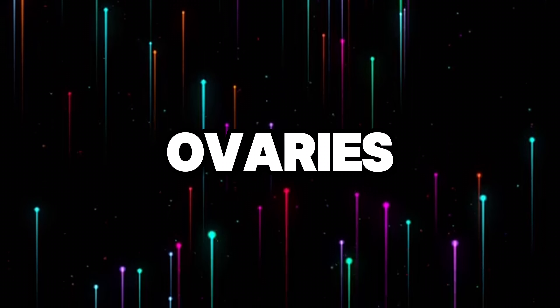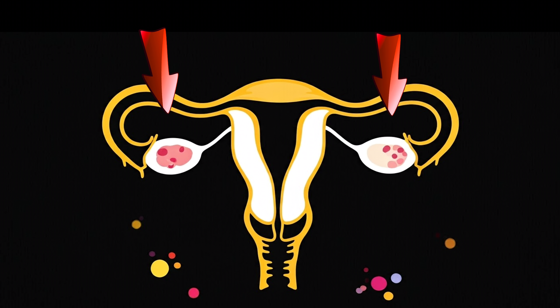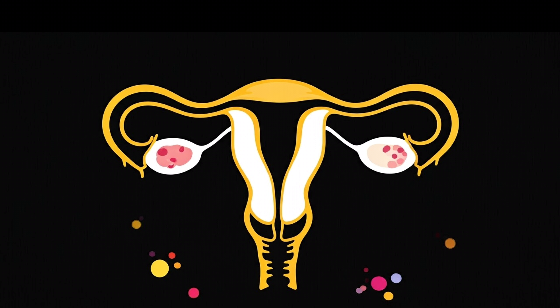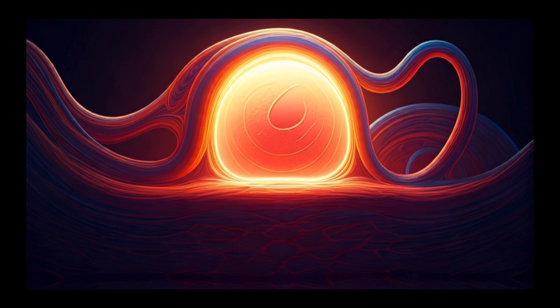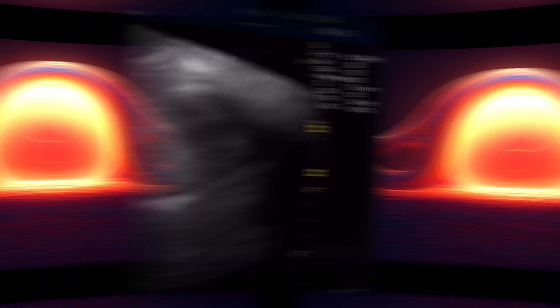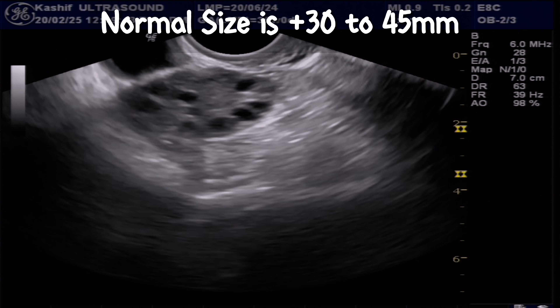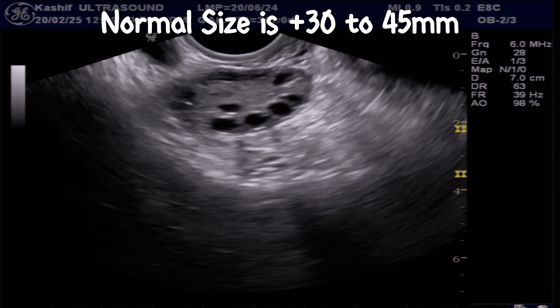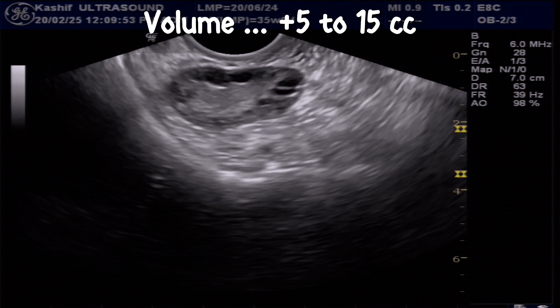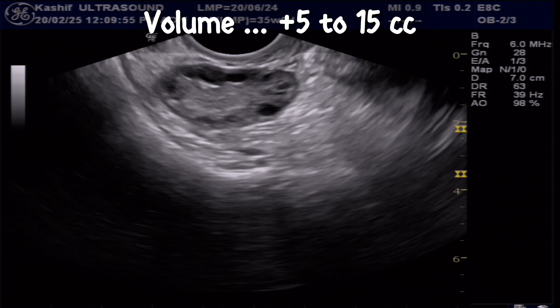The ovaries are a pair of female reproductive organs located in the pelvis on either side of the uterus. Each month, the ovaries produce a follicle which releases an egg into the fallopian tube — a process called ovulation. The normal size of an ovary ranges from 30 to 45 mm, and its volume typically falls between 5 to 15 cm³.